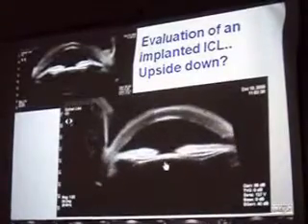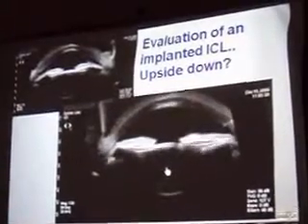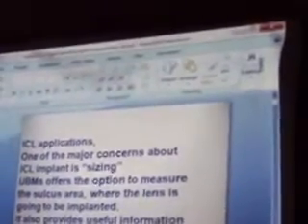Nice case, but nice to be shown, not to be displayed here. It's not nice for the patient. It works. He's probably going to need to receive a cataract surgery pretty soon. And the shame was that it was discovered 2 months after. Okay, let's switch now to accommodation.